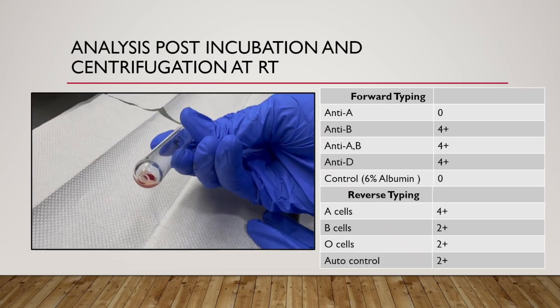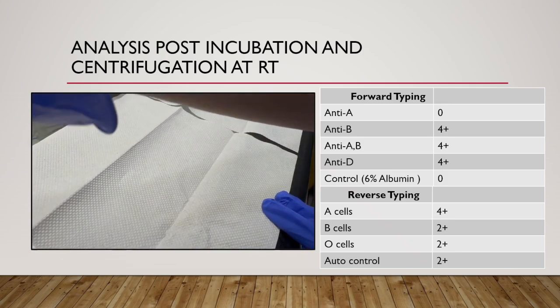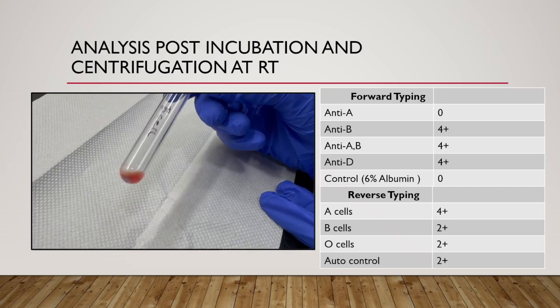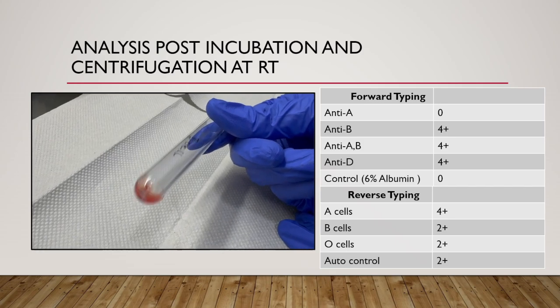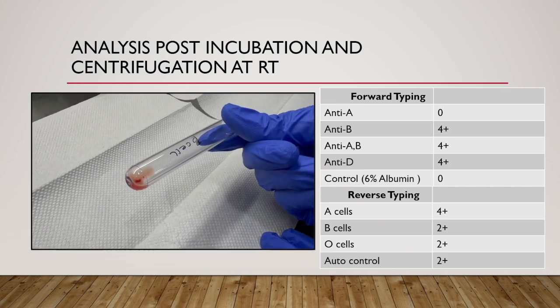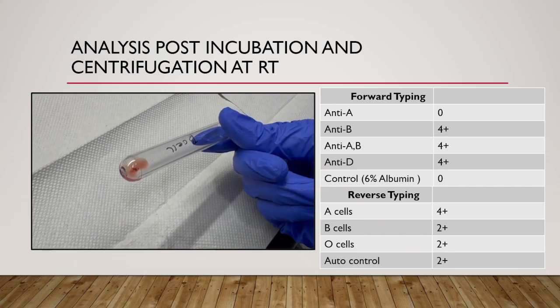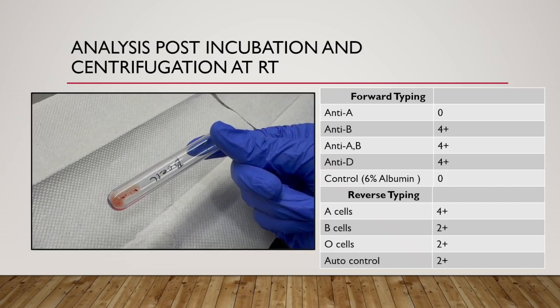Coming to reverse grouping, in A cell, we can say that there is a strong 4 plus agglutination reaction. In B cell, on gently shaking the tubes, we can see that there is a 2 plus agglutination. Since the blood group we found on forward grouping was B positive, we didn't expect to have any reaction on the B cell, but here we are getting a 2 plus reaction in the B cell.